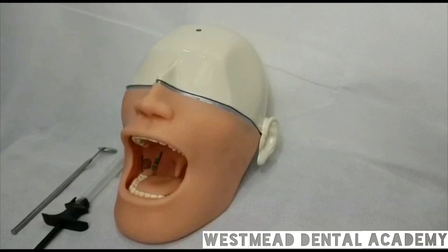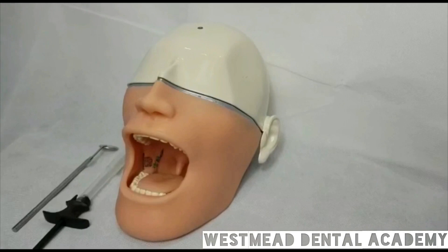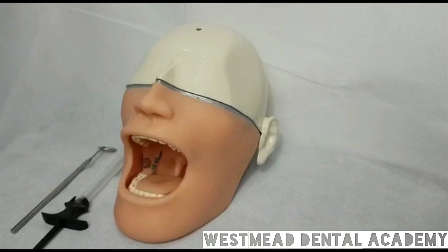Hello everyone. I hope that everyone of you is doing well. As you see, we have brought a new guest to the Academy. It is a newly introduced EDC Local Anesthetic Mannequin, which will be used in the OSCE exam. So, I am happy to demonstrate the direct technique of inferior alveolar nerve block anesthetic today.